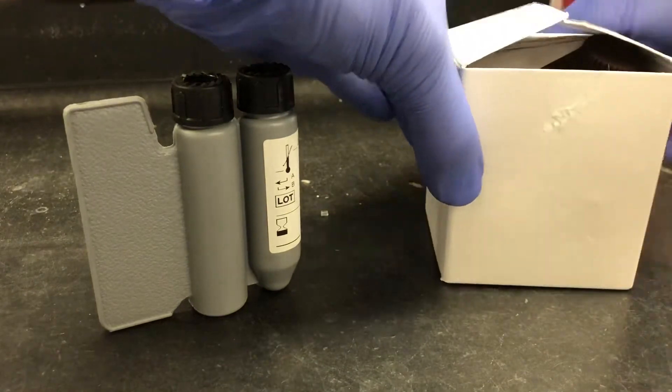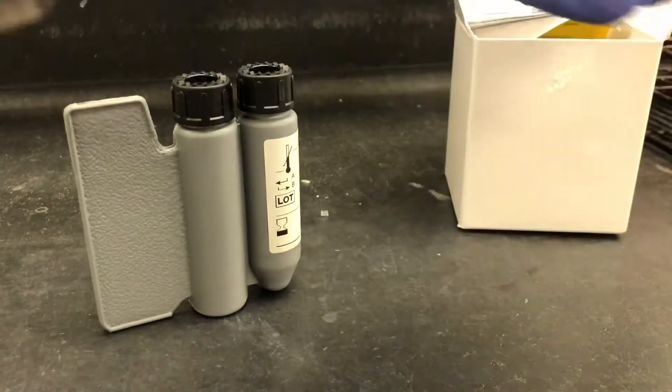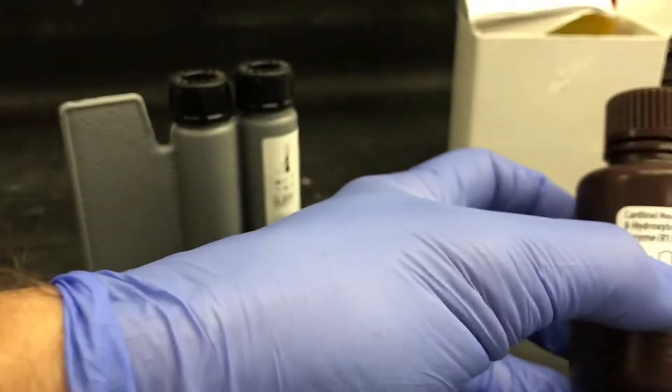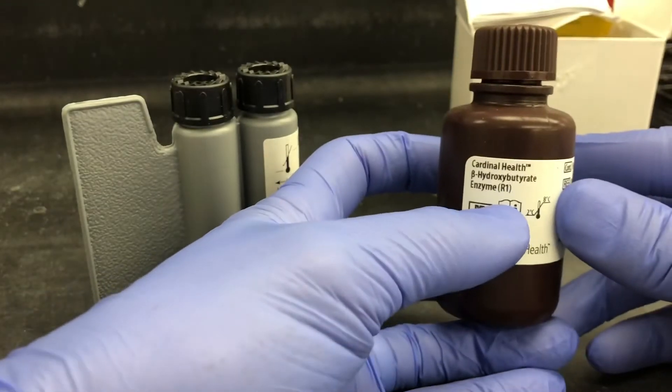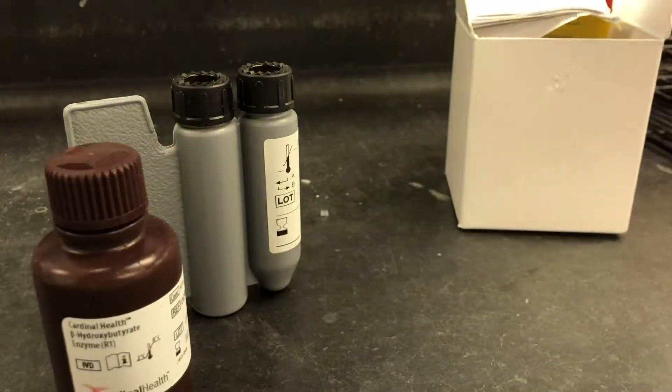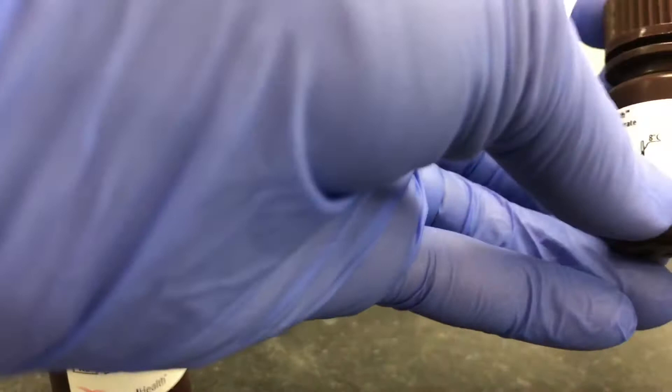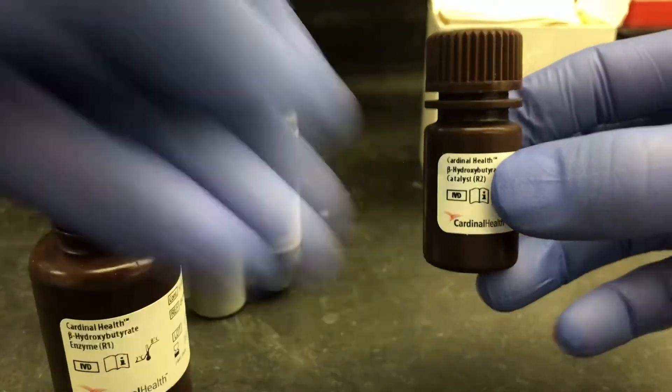Just so you can see what the contents of one of these reagent kits looks like. In the beta-hydroxybutyrate, you have one container labeled for R1 and another container labeled for R2.